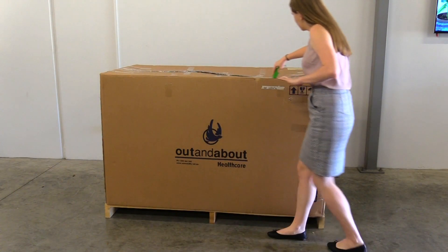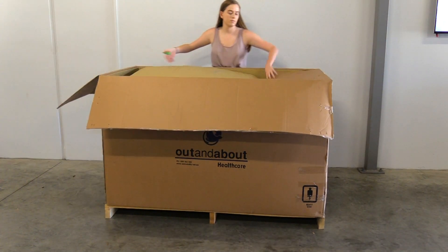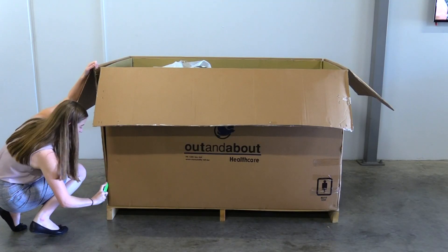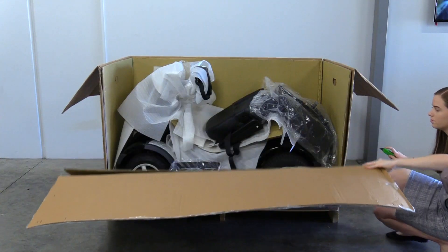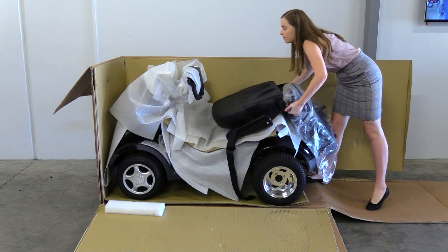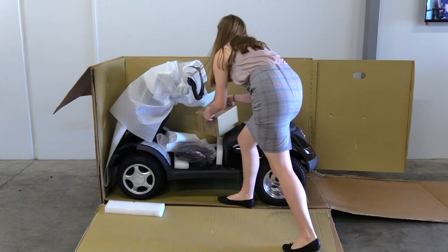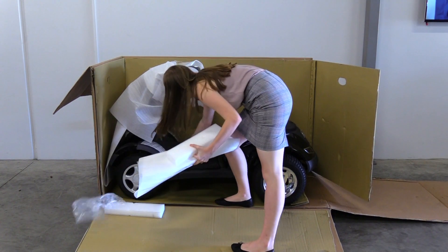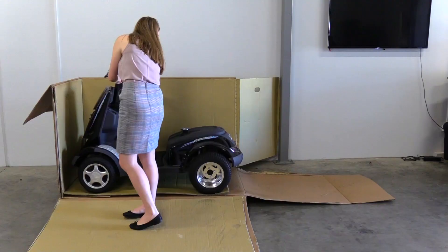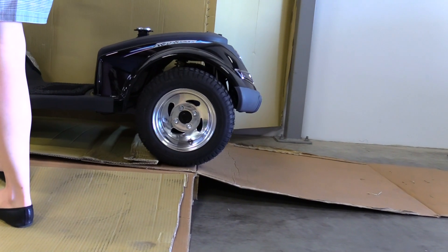Now that you have your brand new Aviator, it's time to open it. We recommend cutting the sides of the box to make getting your Aviator out easier. Remove the seat and remove any remaining packaging from the scooter. We recommend driving your scooter off the pallet — please note the lip as you drive your scooter off.